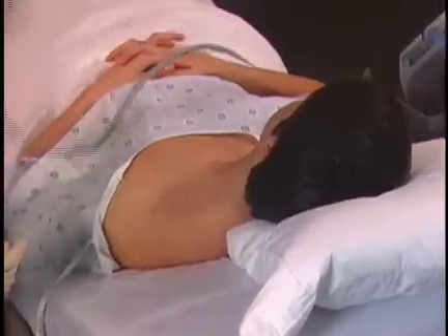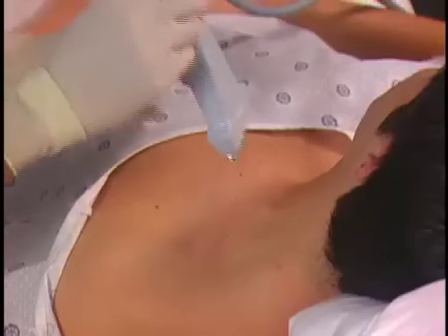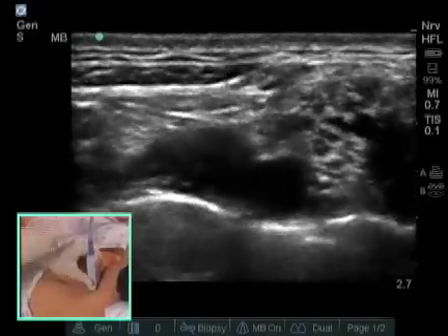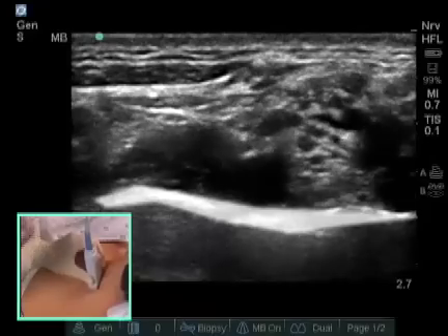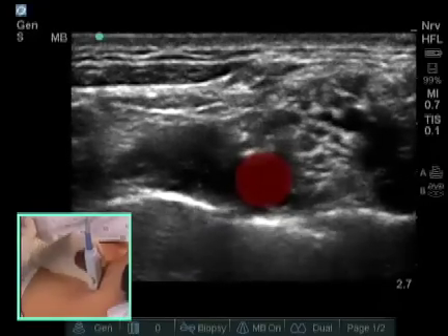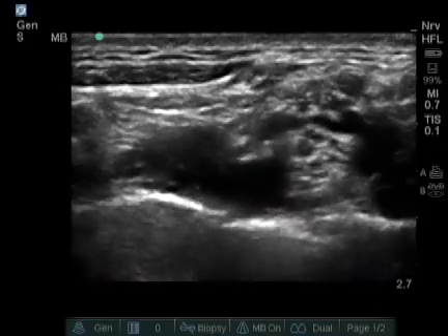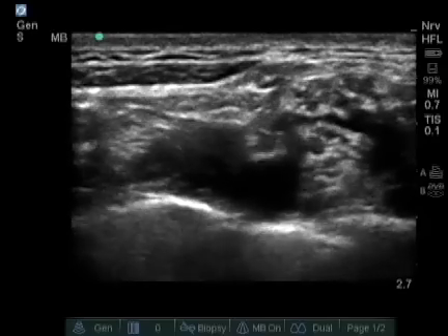We use a high-frequency linear probe for the supraclavicular block. Our nerves should be found a half a centimeter to two centimeters below the skin. I have oriented the probe so the left side of the screen is anterior and the right side of the screen is posterior. In this setting, we now see a bright white stripe going across the screen with a pulsating subclavian artery sitting on this bright white stripe. This stripe can be either first rib or it can be pleura. Your needle tip should never be below this stripe.